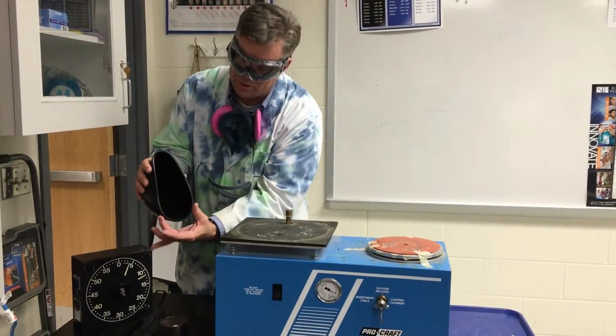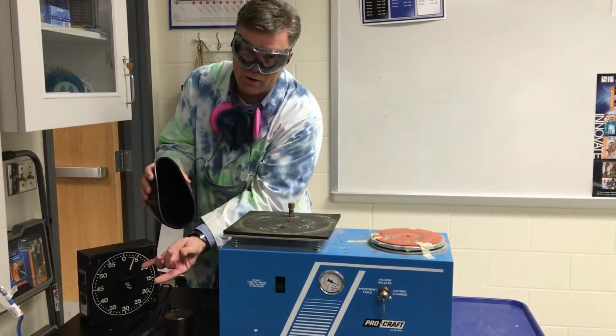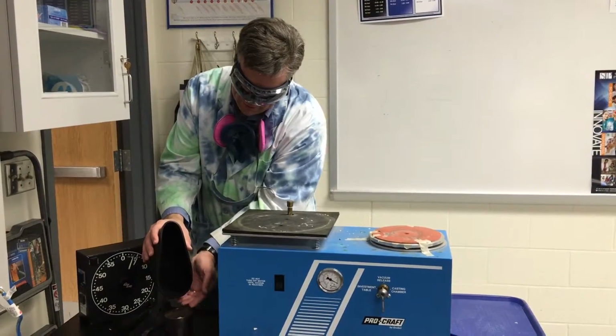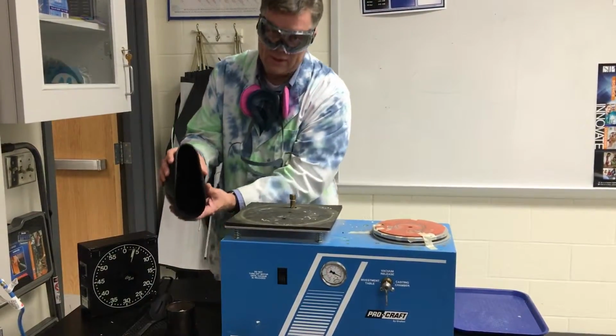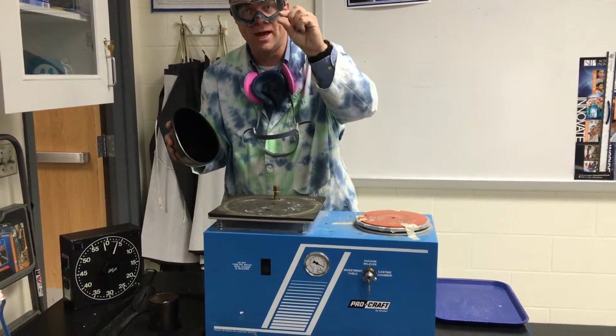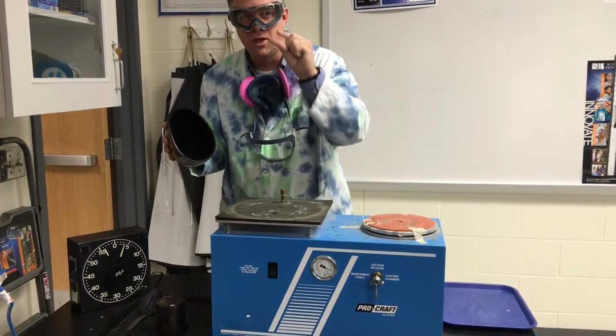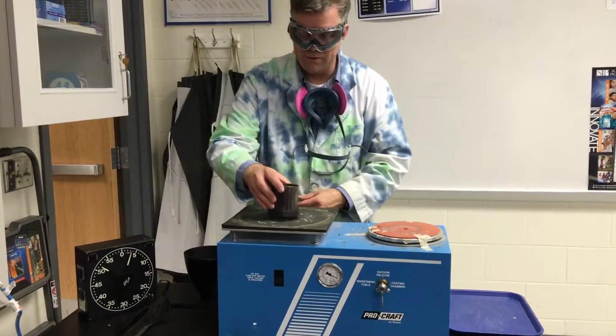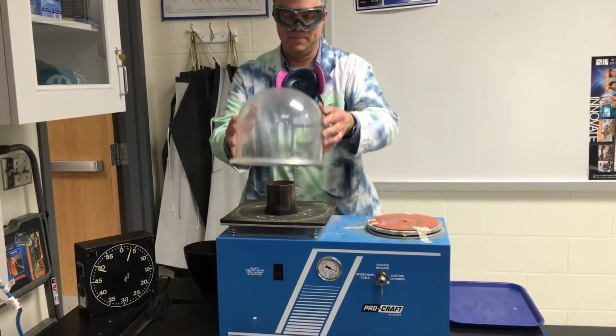What you'll do is it'll start to go down, if you've ever done batter, and then it's going to get narrower. You'll have more control about this high up. So you're going to go ahead and put the batter up. The investment's going to come all the way to the top. When it reaches just the top, leave about that much from the top. I'll try to coach you through when you get close. When you get there, put this down. This comes back, it goes on the table. We do it one more time.